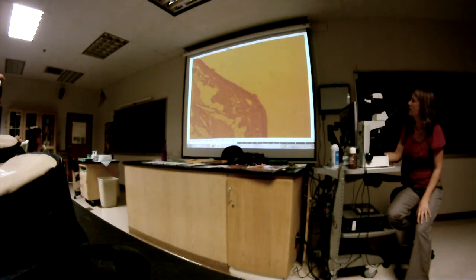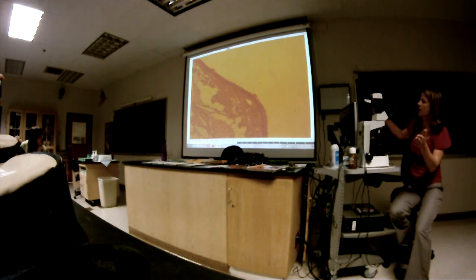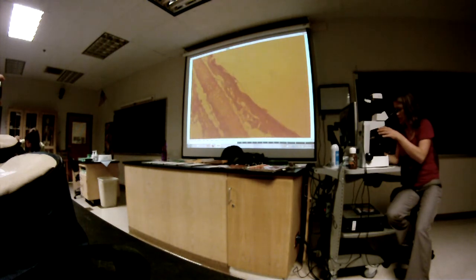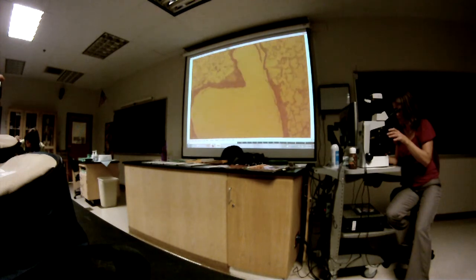Okay, it does have the same pseudostratified ciliated columnar epithelium. You may be able to see the cilia at this point. This isn't our best slide, but we don't have time to search for it. There's some smooth muscle going to be right behind the epithelial layer. And then there's your hyaline cartilage again. Okay, and then last minute.